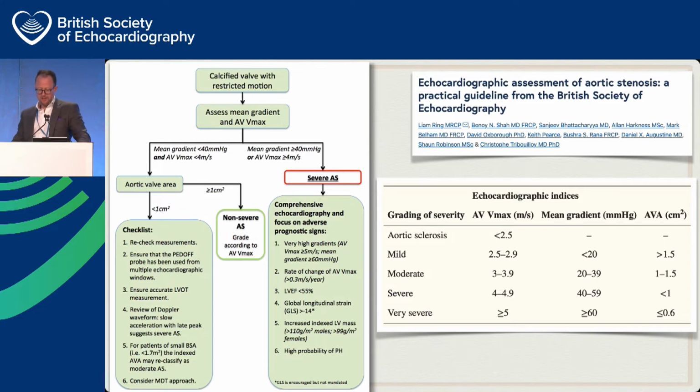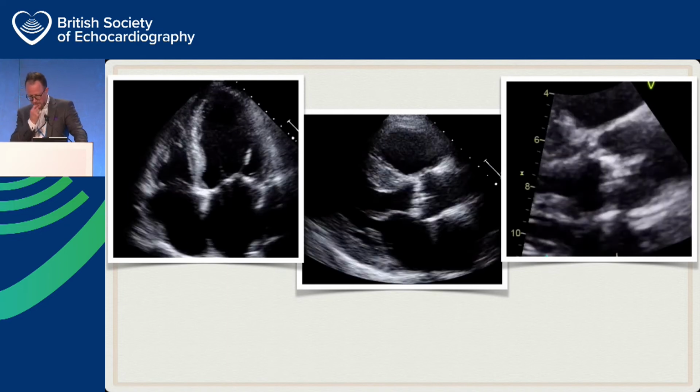And never one to shy away from showing off in some vague way, we've got some guidance, which a lot of us wrote and took a lot of time and effort over, but we're very pleased with. And the cornerstone, as I've said, is the Doppler indices. As I said, most of the time the Doppler indices and the valve area will agree as to how bad that valve is. But not all the time.